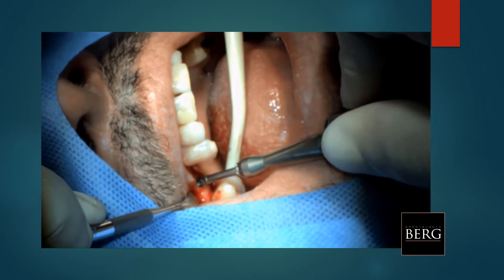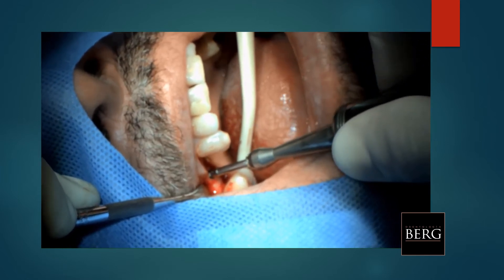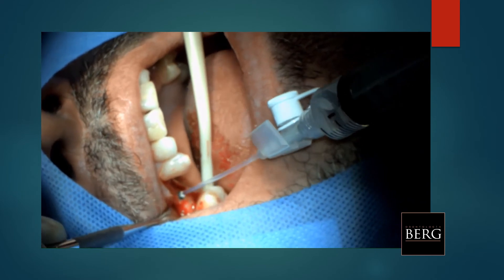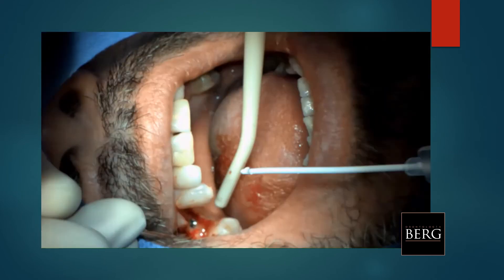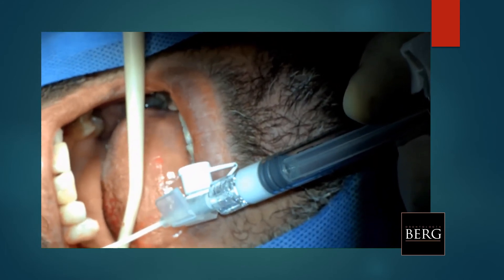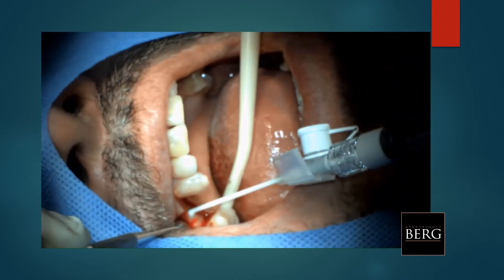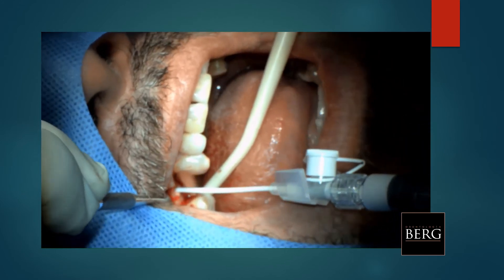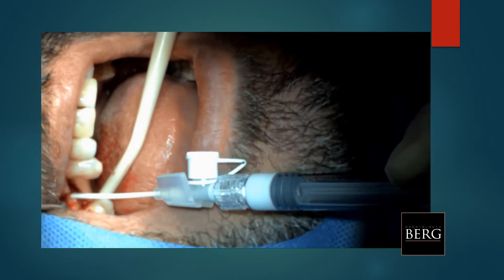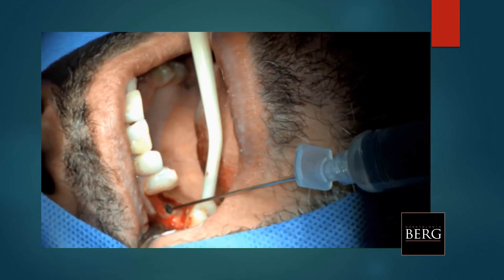Check the implant. By hand, slow rotation, keeping good check of membrane integrity. Last cc — and now graft. Through the implant, this is beta-tricalcium phosphate inside a hyaluronic acid gel, and we inject. We normally have 0.5 cc, which is more than enough. You have to check because sometimes we receive syringes with one cc and you could be overpacking. We clean the inside of the implant with saline. We insert more bone until the graft material comes back through the implant.